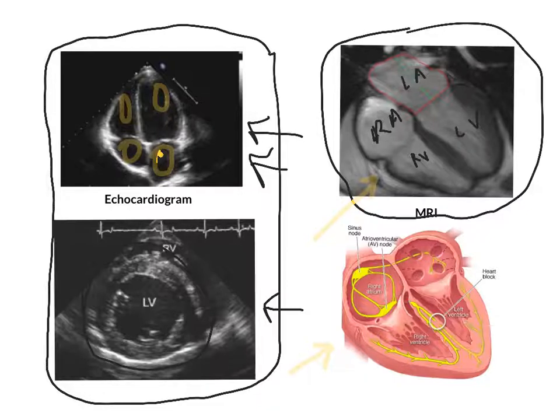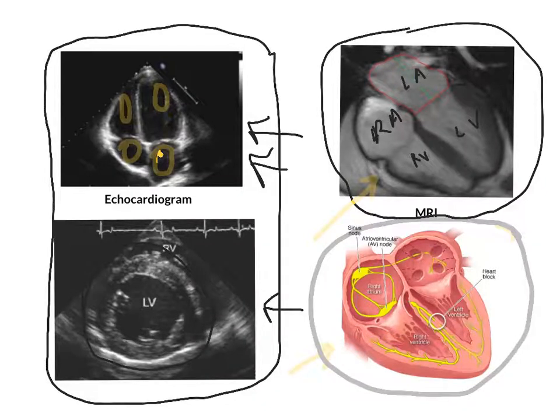The view down here, the picture right here, is just a picture of the electrical activity in the heart and how that works.